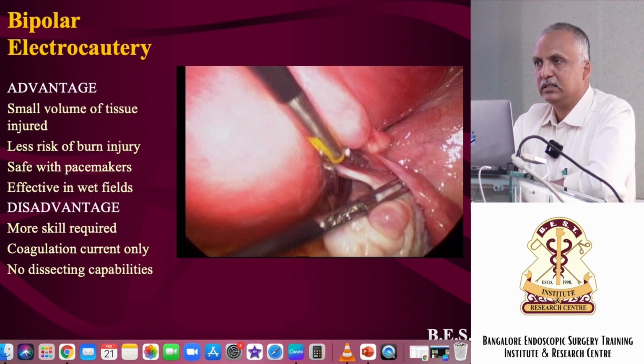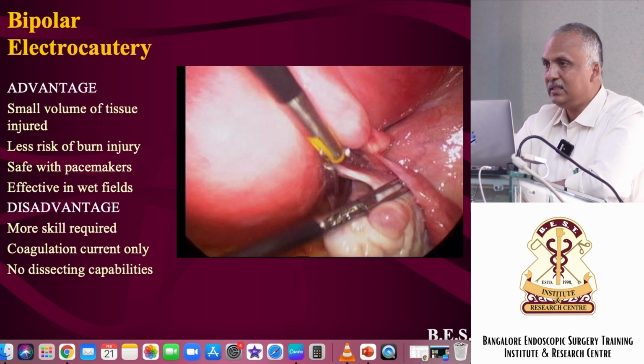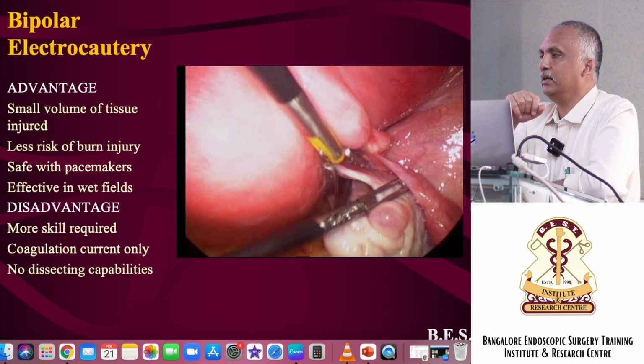a twisted ovarian cyst which has got untwisted, whatever it is, there is a lot of edema, and the edema would have increased a lot in 4 to 5 days. First day, second day not much, later on it is much more, and that is when you see there is bleeding when you use monopolar. When you use bipolar, you don't have bleeding.